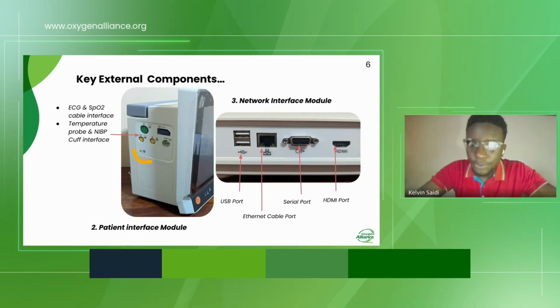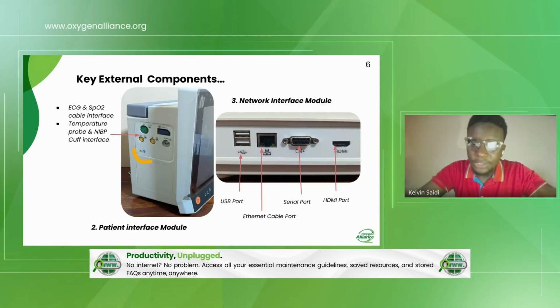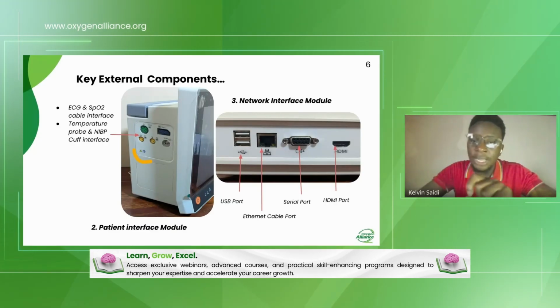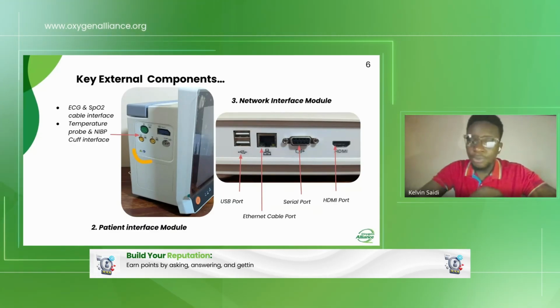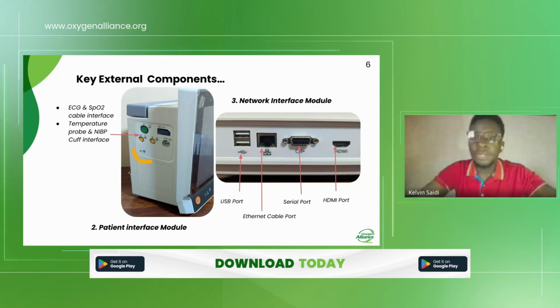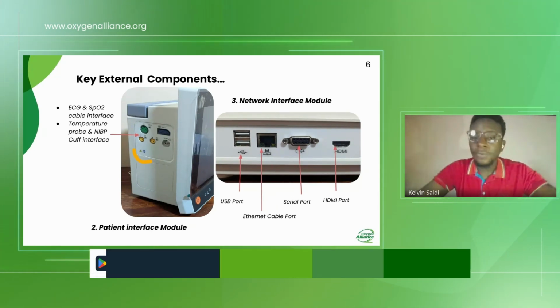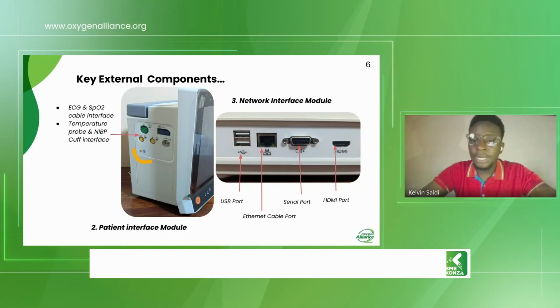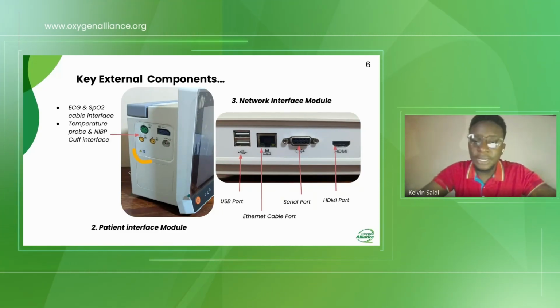So some of these ports have arrows, which should match the probe or lead that is going in that port, so that there should not be a mismatch, which can result in wrong results. So these arrows help the users to easily install the probes and the leads.